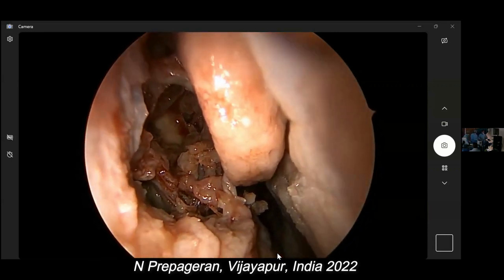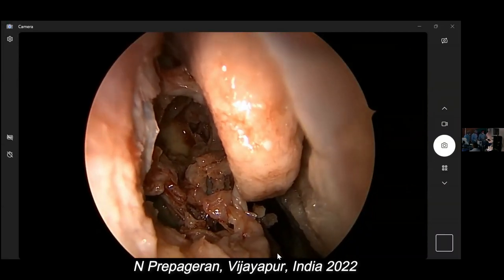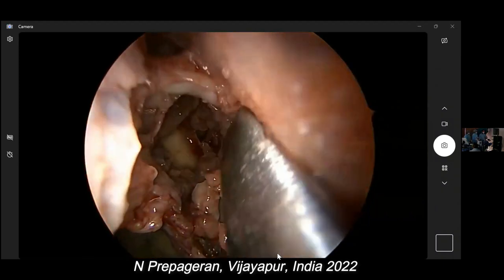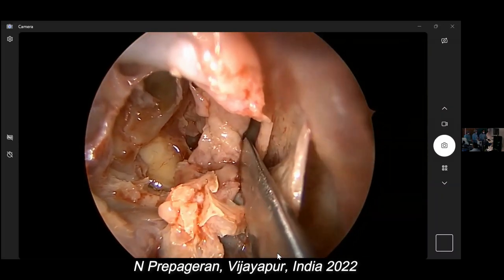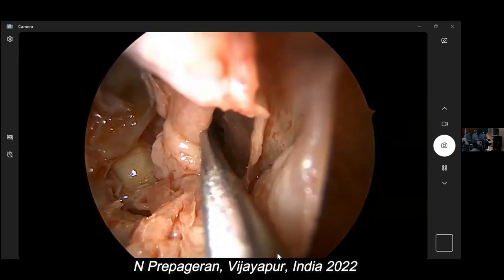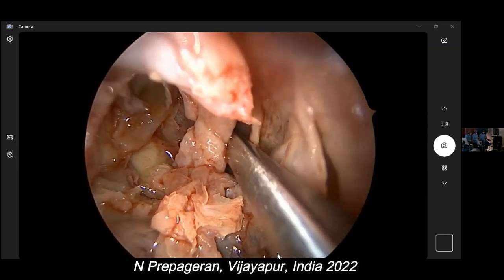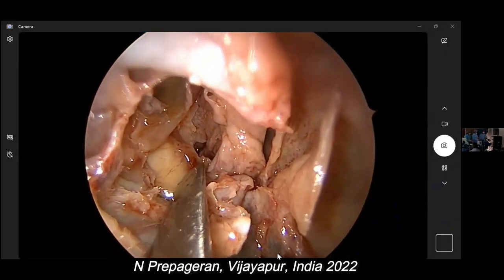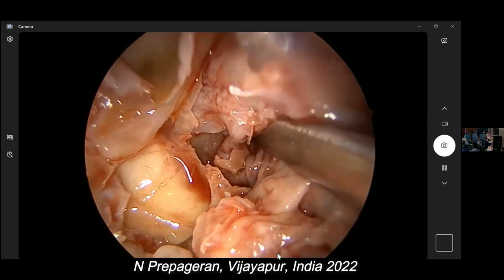Sir, can we reconfirm by going medially to the middle turbinate? Oh, sure. Freer elevator. Yes. So at gate number four, to make sure you're in the posterior ethmoids, you just go medial to the middle turbinate. If you go medial here, you find your superior turbinate. If you find the superior turbinate and you go medial, you find the sphenoid ostia. Yes, there's a sphenoid ostia there. So if you see the superior turbinate, you have to be in the posterior ethmoid. And for the sphenoid opening, you just go down, medial, and you're in the sphenoid opening. There's the sphenoid opening here.